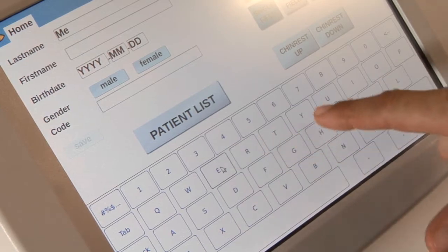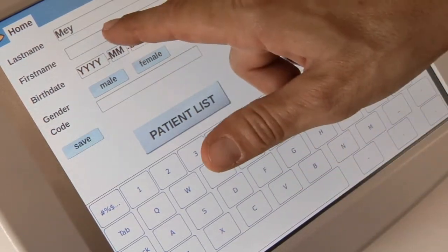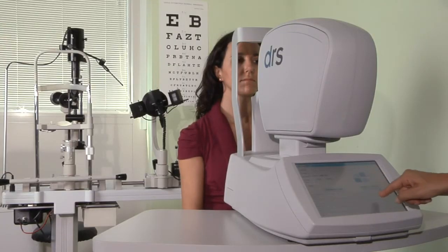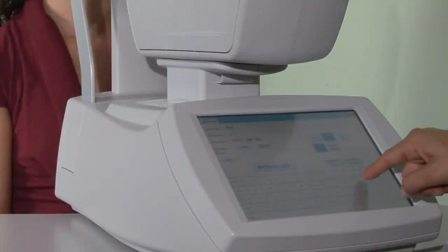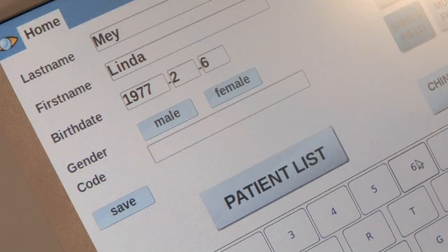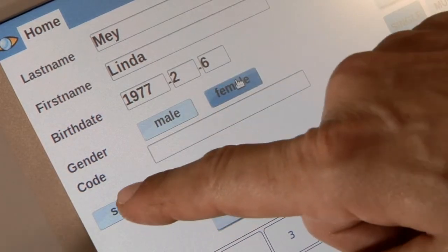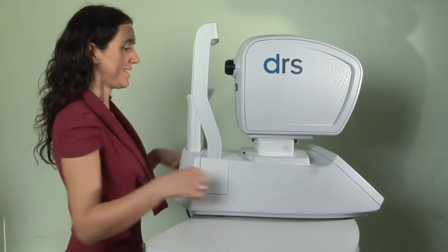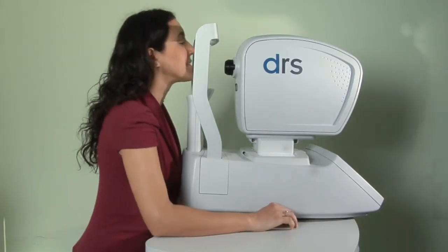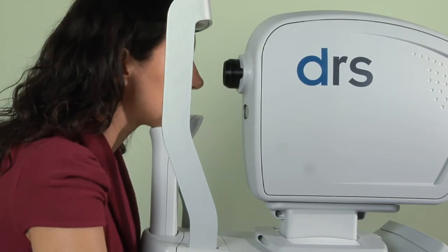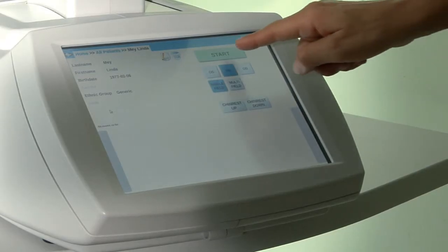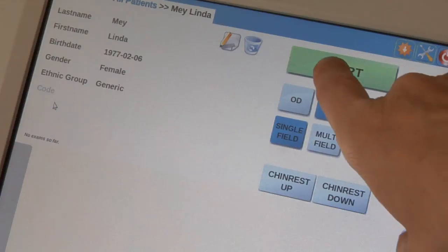Extremely easy to use and affordable, it features touchscreen operation that requires minimal operator training. All you have to do is insert the patient's name and data. Simply have your patient sit comfortably in front of the DRS and have the patient rest her or his chin on the chin rest. Then press Start.